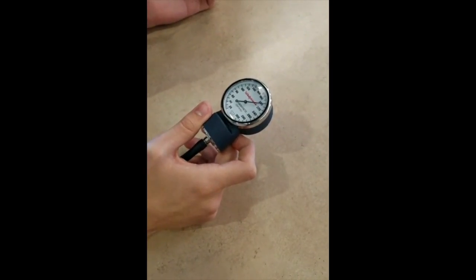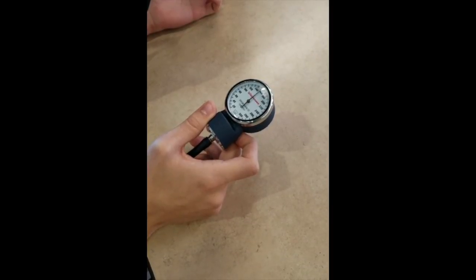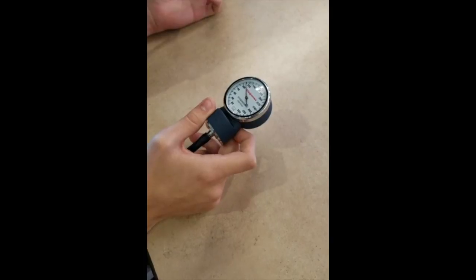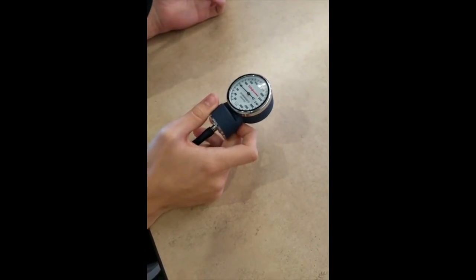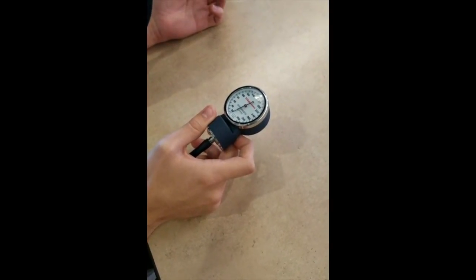After reaching 200 millimeters of mercury, slowly release the pressure at a rate of 2 to 5 millimeters of mercury. Carefully listen for the first sound, which is the systolic reading, and listen for the final sound, which is the diastolic reading. The subject's resting blood pressure was 110/80, which is considered to be normal.